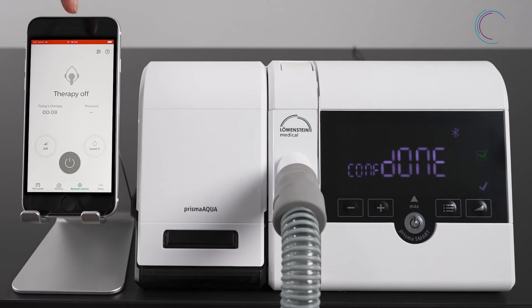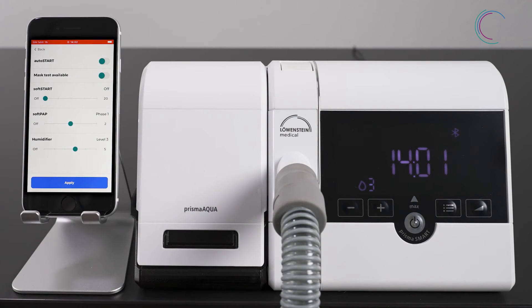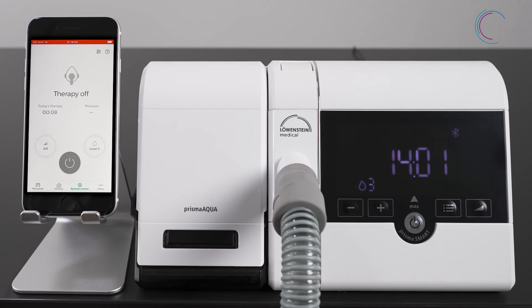Alternatively, you can go to the settings menu in the upper right corner, where you also can set the level of humidification. Apply any changes, and whenever you start the therapy, Prisma aqua will start automatically as well.